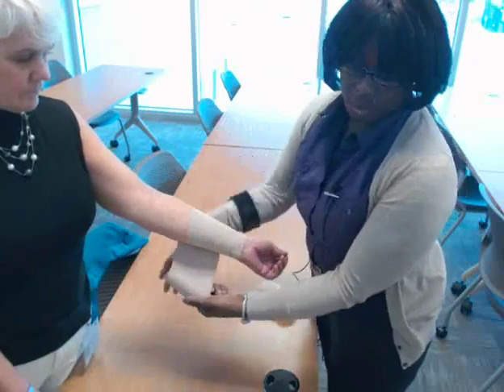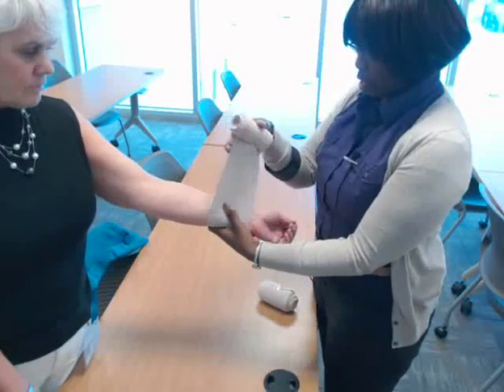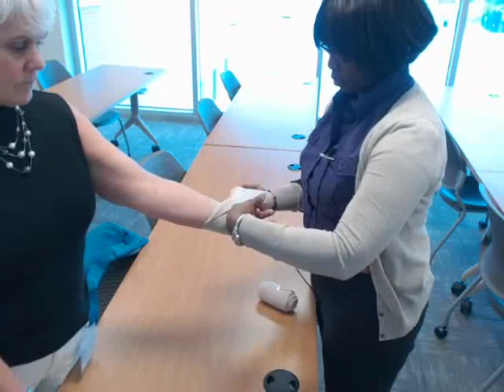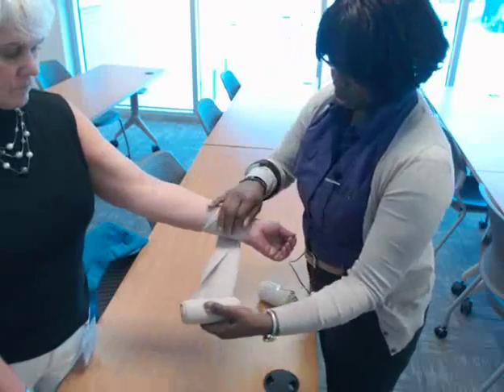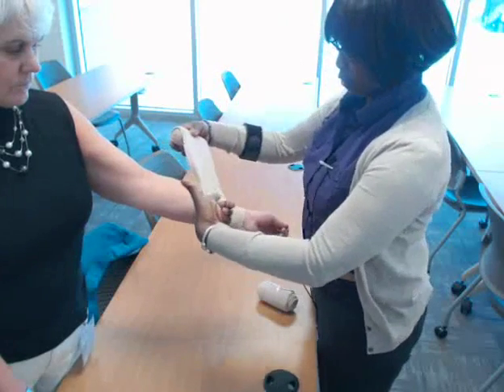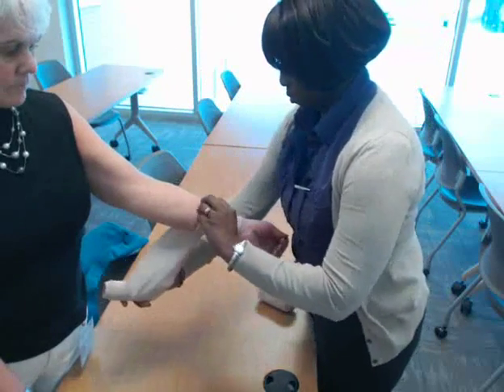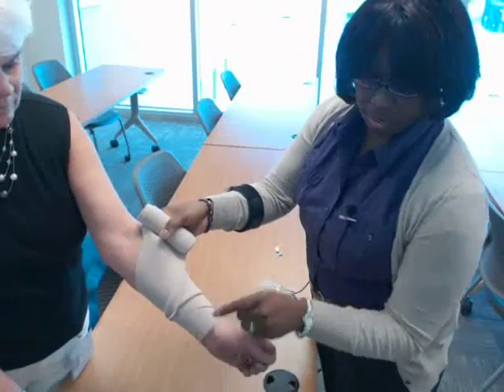Now I'm going to show you the reverse spiral. With the reverse spiral, you again want to start with the circular. You place your finger here in the middle of the turn, and then bring it down and around and up. Come back up and do the same thing again — place your finger here and come down and around. This gives you a nice criss-cross pattern like you see here.